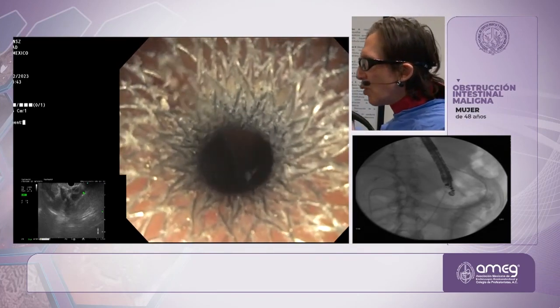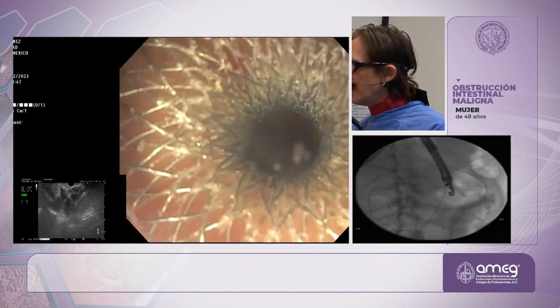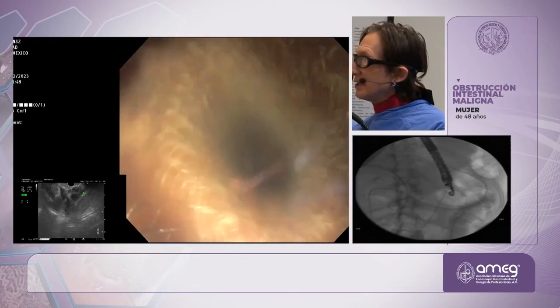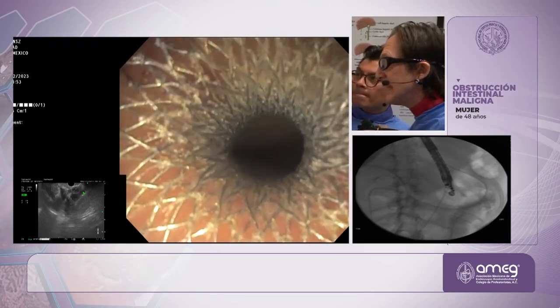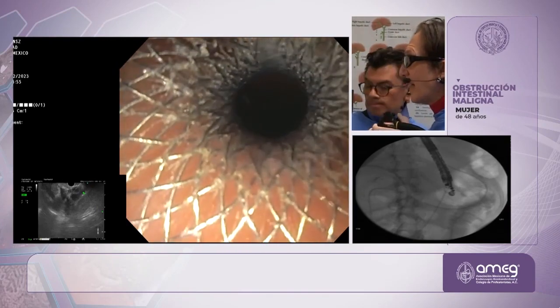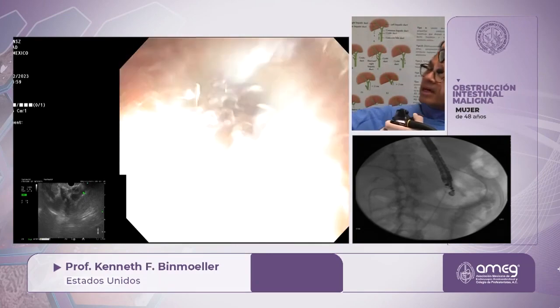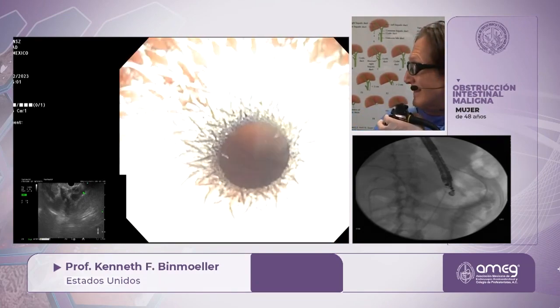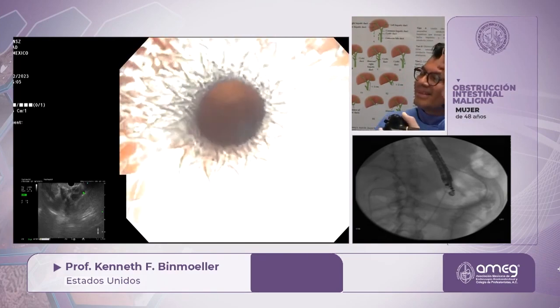Okay. So I just want that one view, if I can get that one view through here, that shows you can see the small intestine. Yeah, I'm pretty sure that's it there. But if you can see the valvulae conniventes, I think they say in Latin. Now you have more light. Okay. One thing's for sure, this is not the peritoneum, okay?